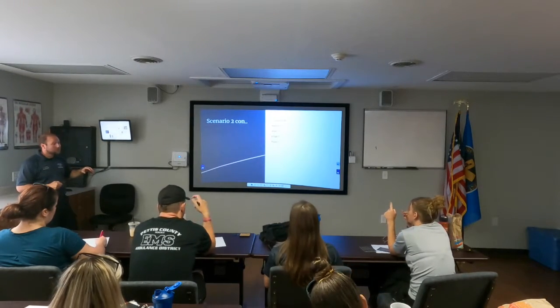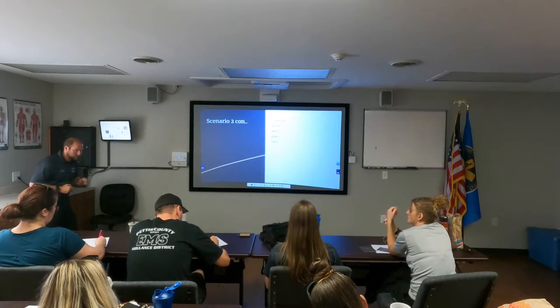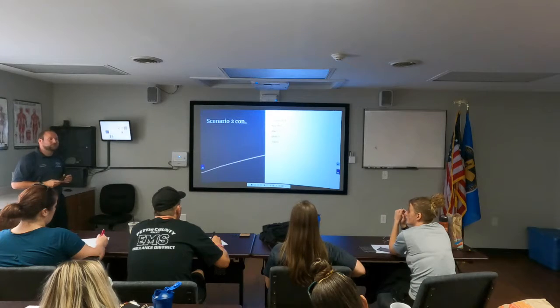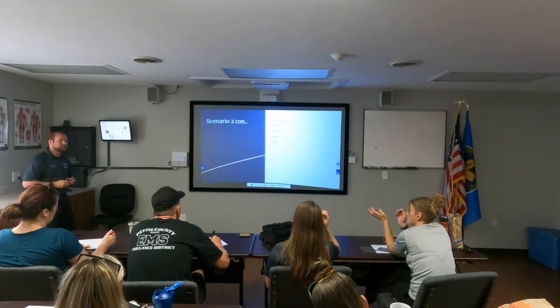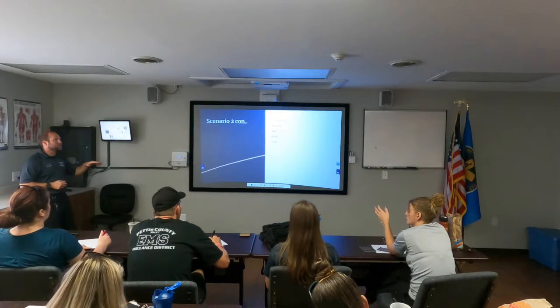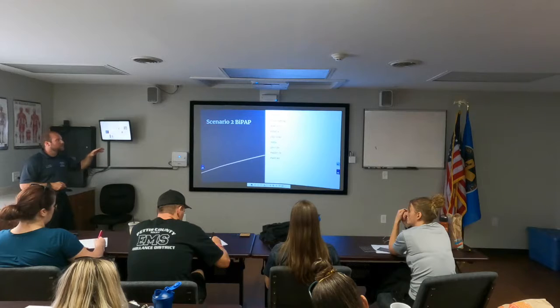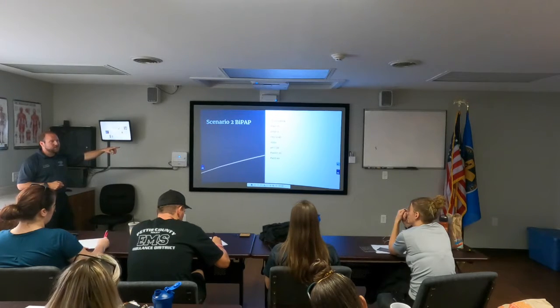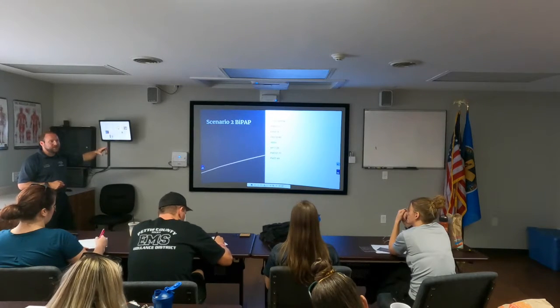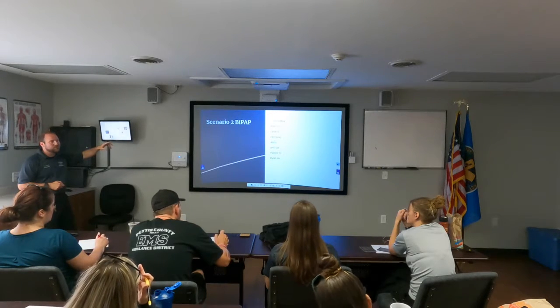So when we go to the vent with the patient, we're going to see IPAP 10, EPAP 4, so our pressure support on our vent is going to be 6, and then PEEP would be 4. So what you will actually see is that if you have an IPAP of 10, we need to add the pressure support to the PEEP, so you will see 10 over 4 for them.